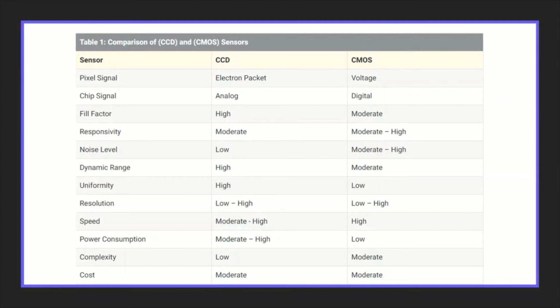sensors with a rolling shutter and in-pixel CDS can be higher than CCD sensors with the same pixel size, the read noise of previous generation CMOS sensors is much higher than that of CCD. This results in a lower sensitivity dynamic range.